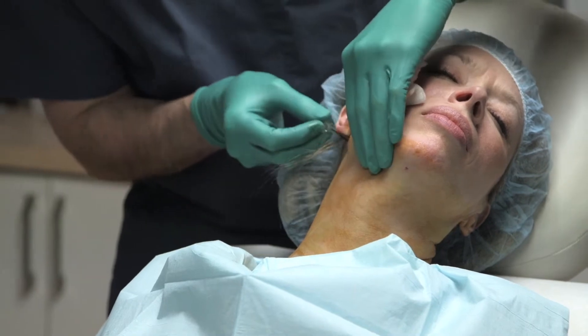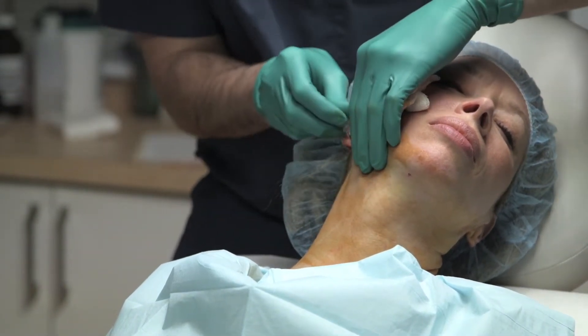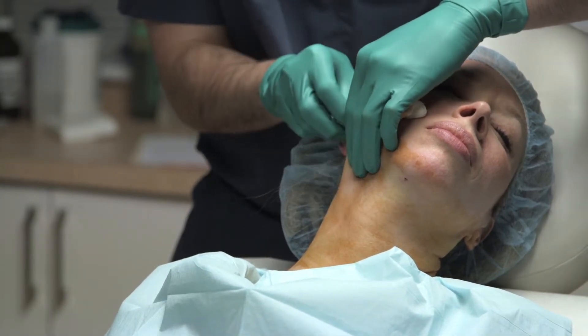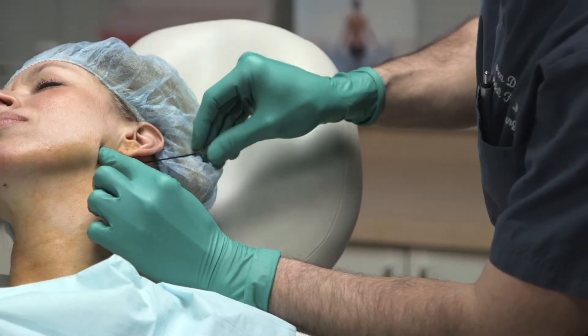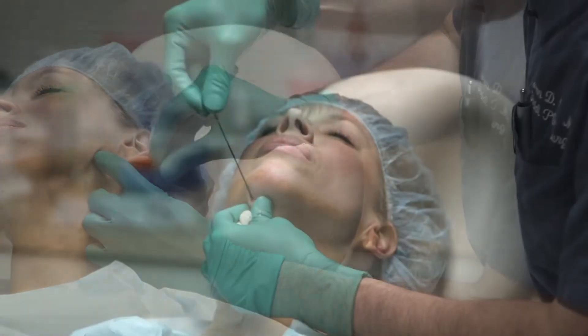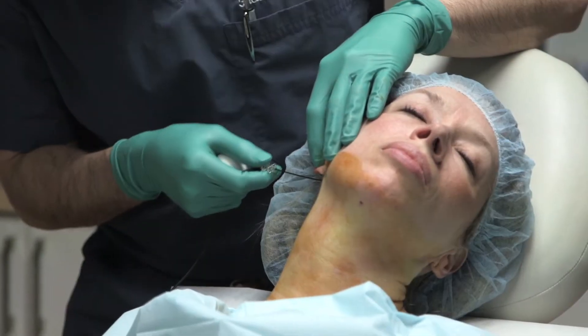This is then used to create dry passes through the neck in order to create a pre-platismal plane that the probe is going to pass through. This pre-tunneling allows the probe to move so it's not hung up on any of its attachments in the subcutaneous plane.